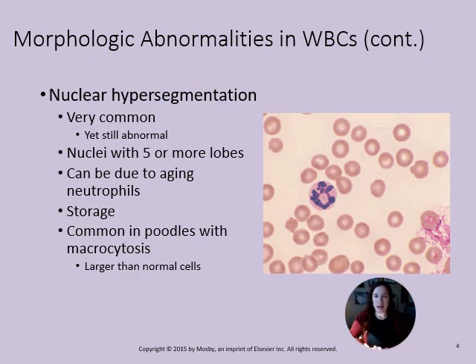It's when we see higher than most, like an abnormal amount. Because also keep in mind the way that we're storing the sample. How old is this blood? That's a big deal. If it's fresh, if it's new, if it's clinical, then we're going to notate that. Okay. Anyways, why are we going to see hypersegmentation?